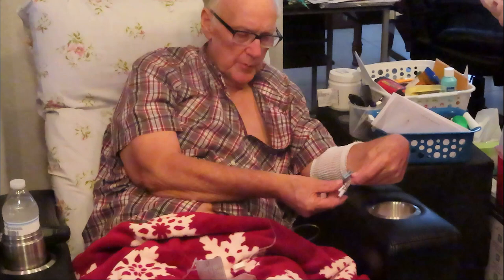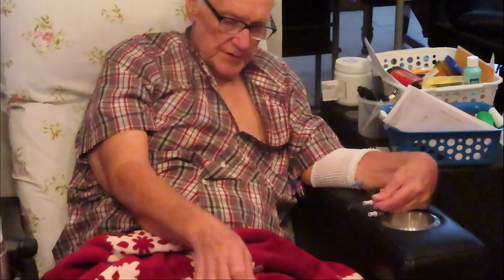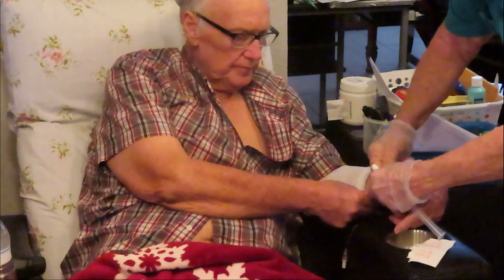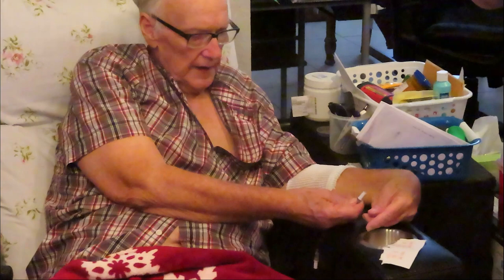So this I'm going to remove from here to here, which I already did. I'm not going to put it back on because it's contaminated. So this is done. So you take this, throw it in the garbage. Okay, now my wife's going to clean each fitting off. She uses one pad. I yell at her when she gets too close. And clean it. Then I end up holding it. She takes the saline first.